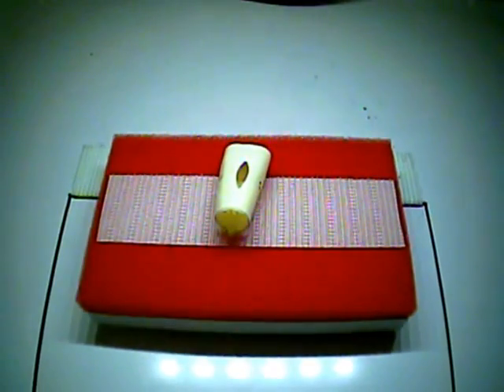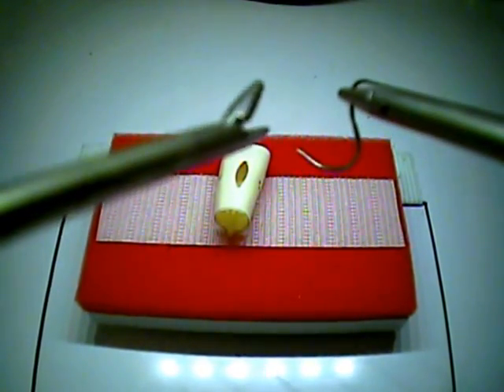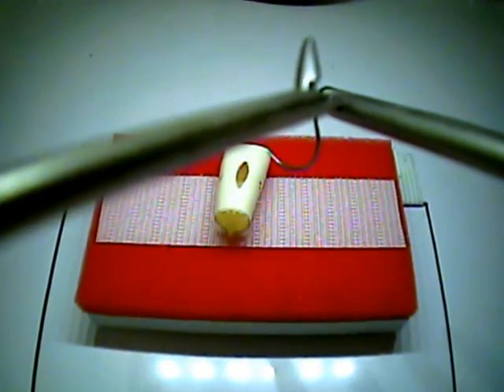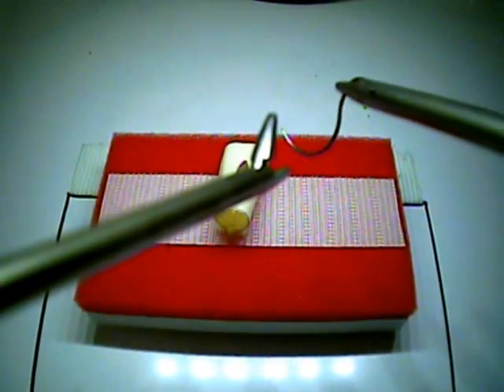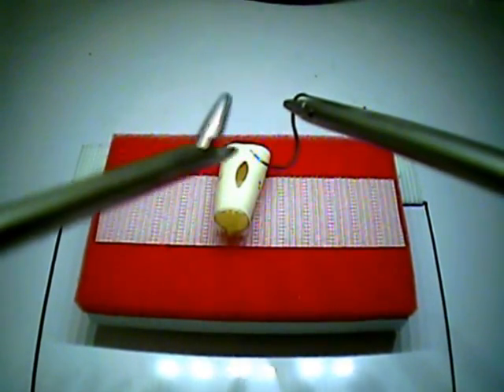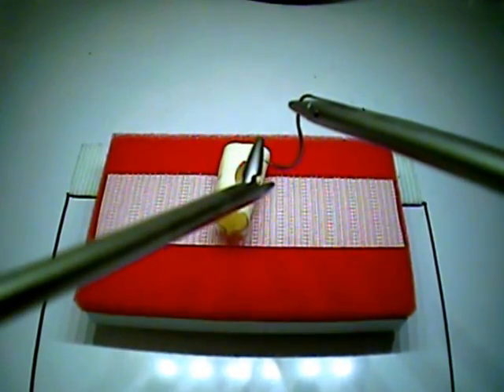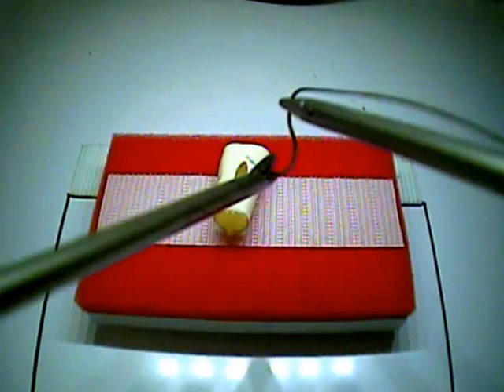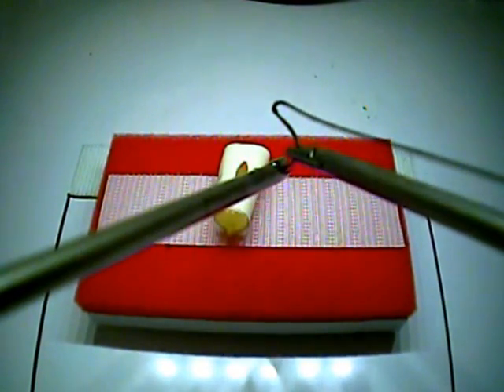Task number four: the extracorporeal knot. For this exercise, you'll be given two needle drivers, a pair of scissors, a knot pusher, and one long suture. For the purpose of this demonstration, we are using size one silk with a v20 needle, but for your testing purposes, you will probably be given a 2-0 silk suture, and we recommend that you practice with something equivalent to that.